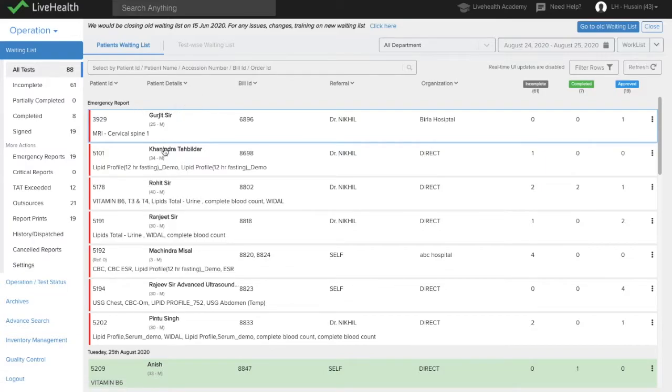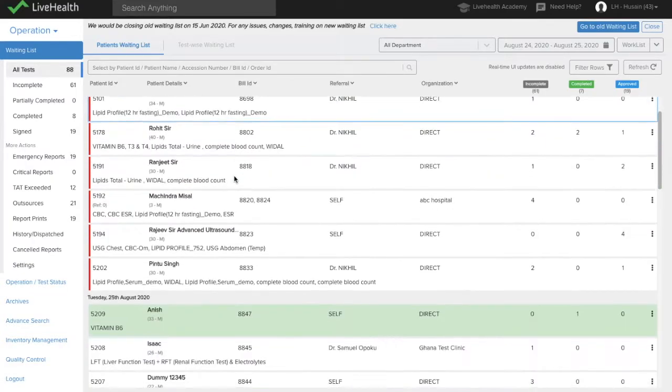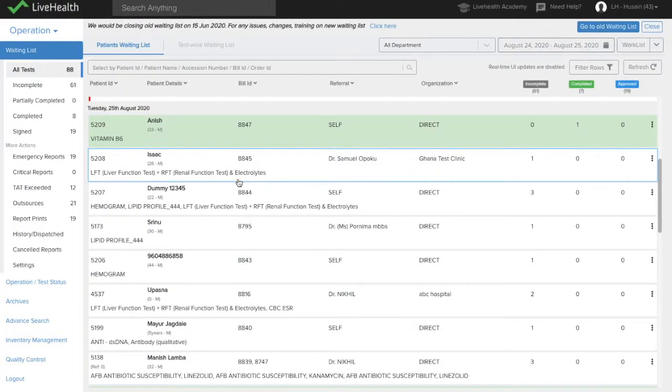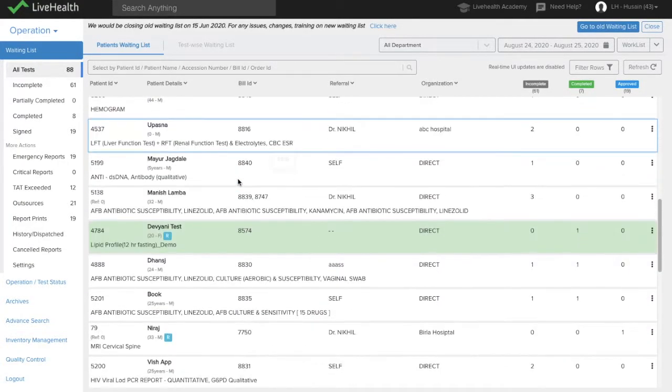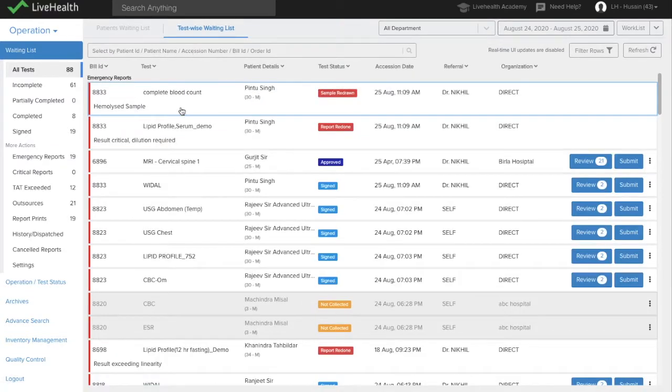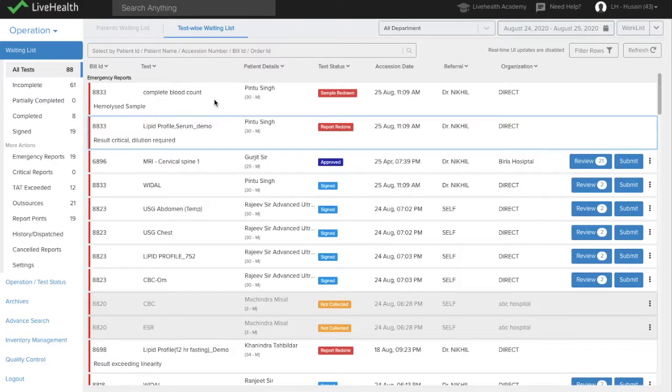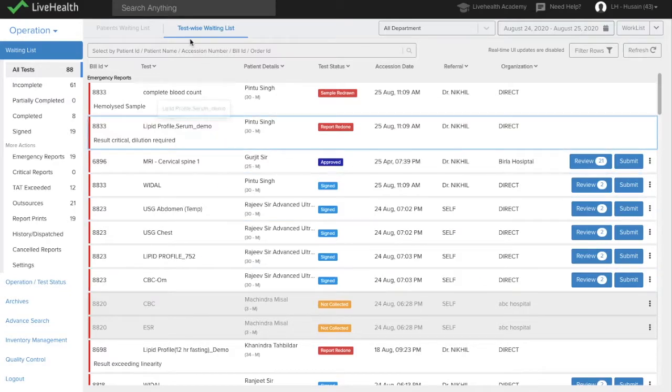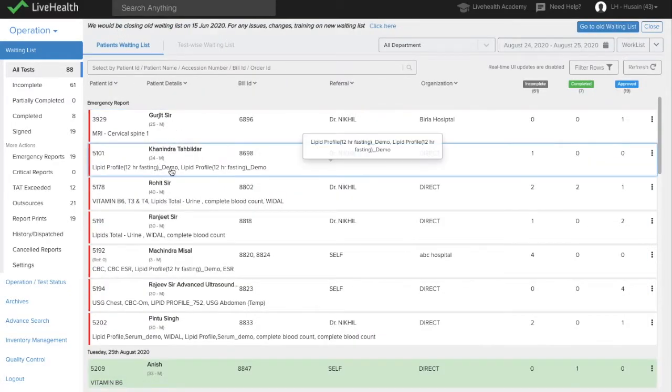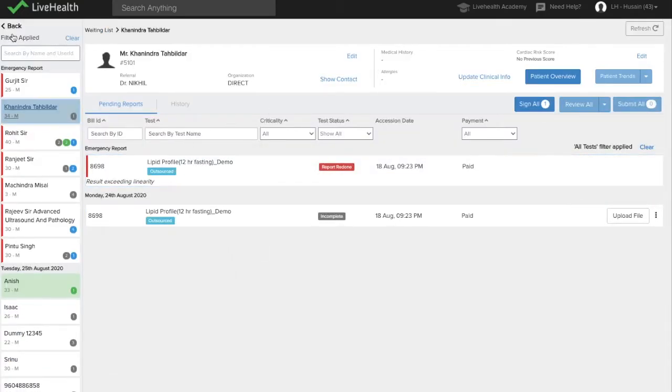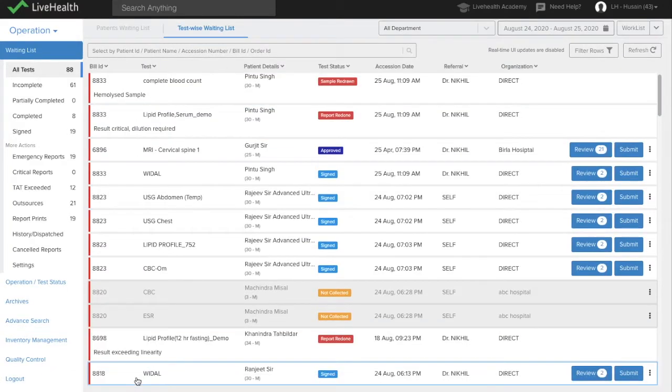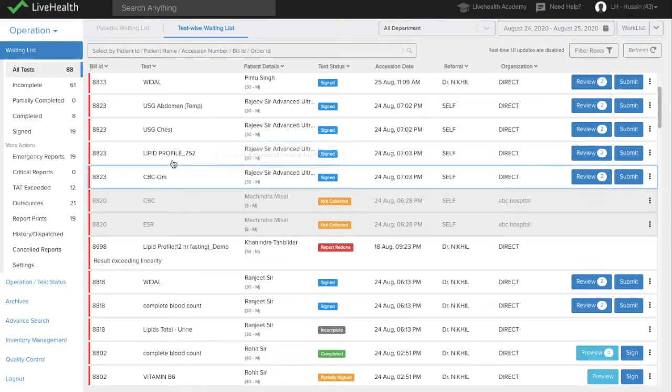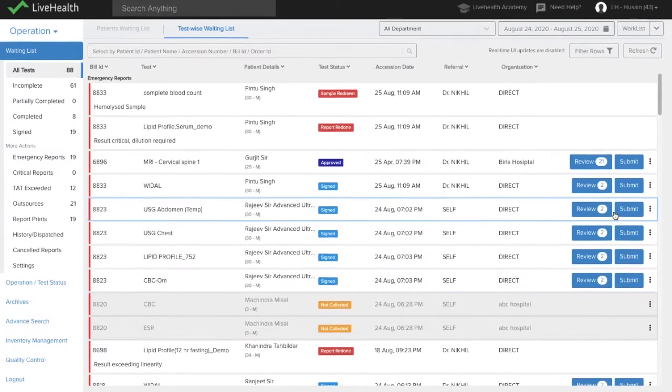In patient-wise waiting list, you can see the different patients whose reports are there in the waiting list. In the test-wise, the tests are open. So you can see all the tests directly over here. In the patient-wise waiting list, you need to open the patient to see the tests of those patients. But in the test-wise waiting list, you can see all the tests open and the patient name against them and you can open the reports directly from here.